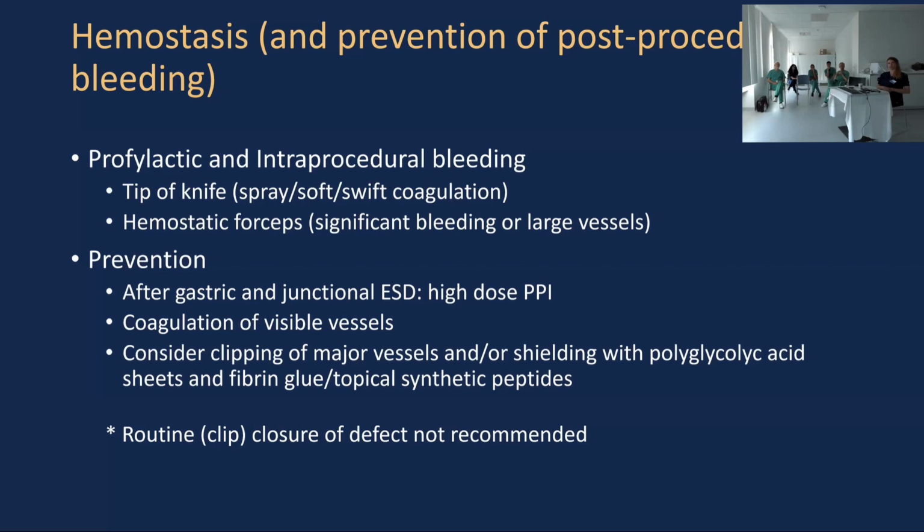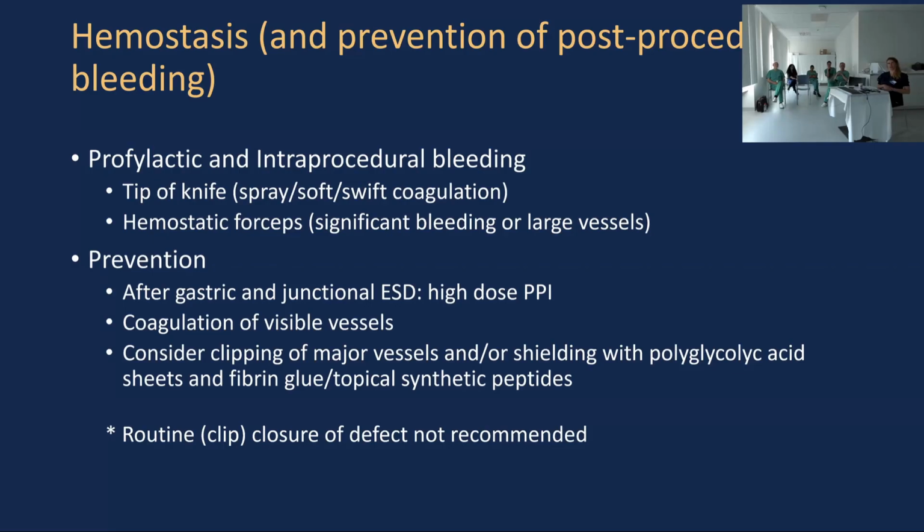So why do that? If you have a very big vessel in your tunnel that you want to treat before you cut it, we also tend to do it with the knife actually out and go very slowly. So we at least give 5 taps next to the vessel, and then you just see it coagulate away. But if you sometimes have major vessels, 2-3 millimeters, we will still take out a coag grasper and then with soft coagulation treat it before we cut it.